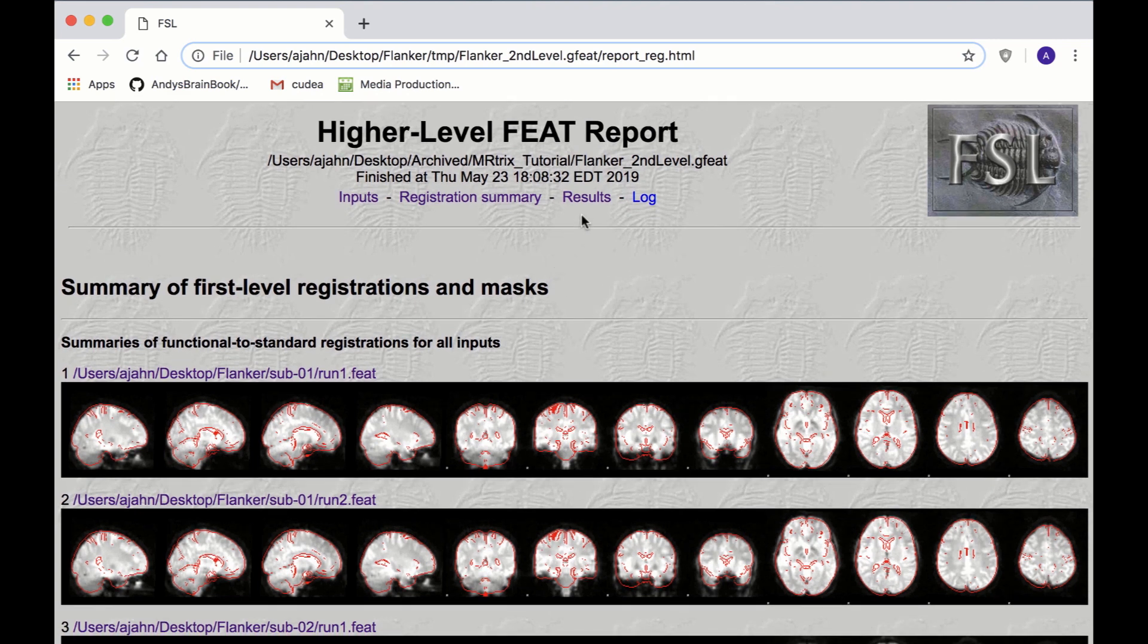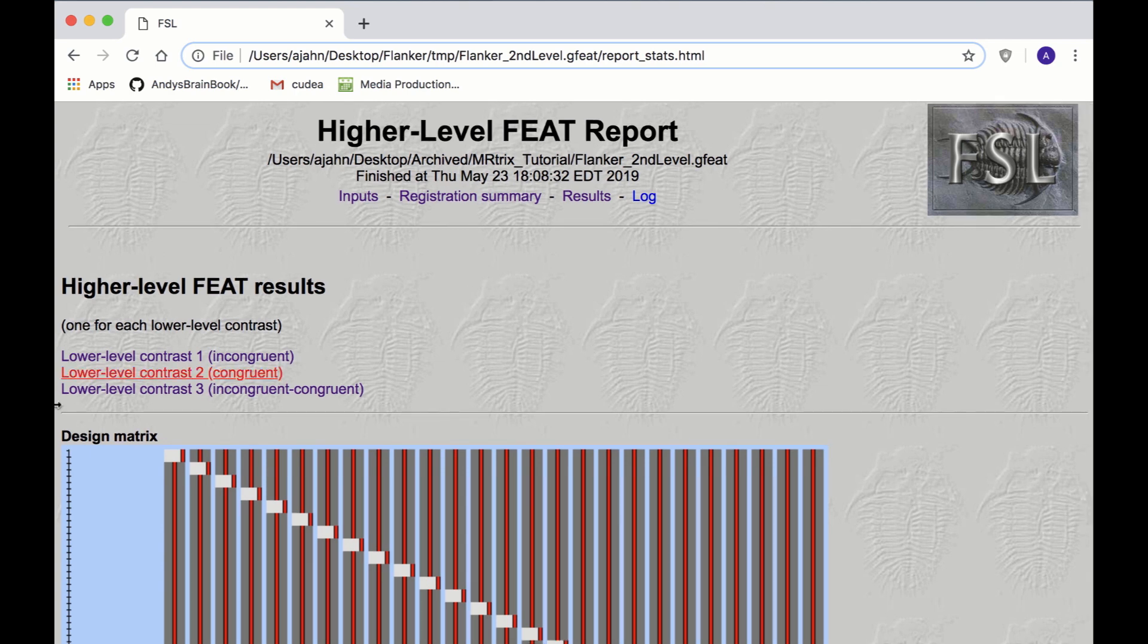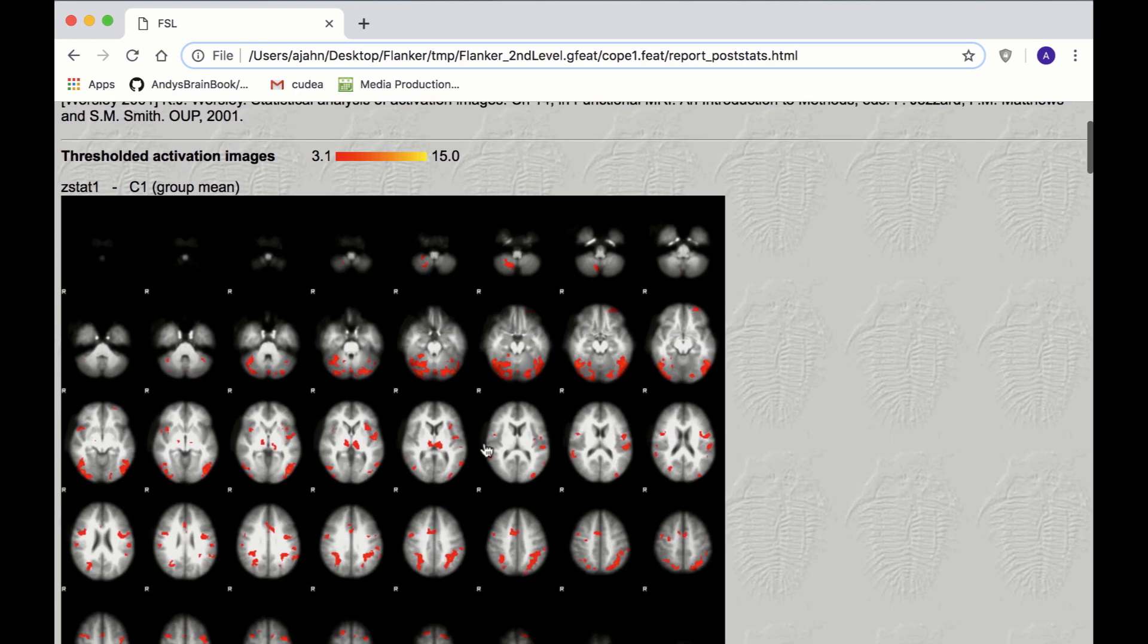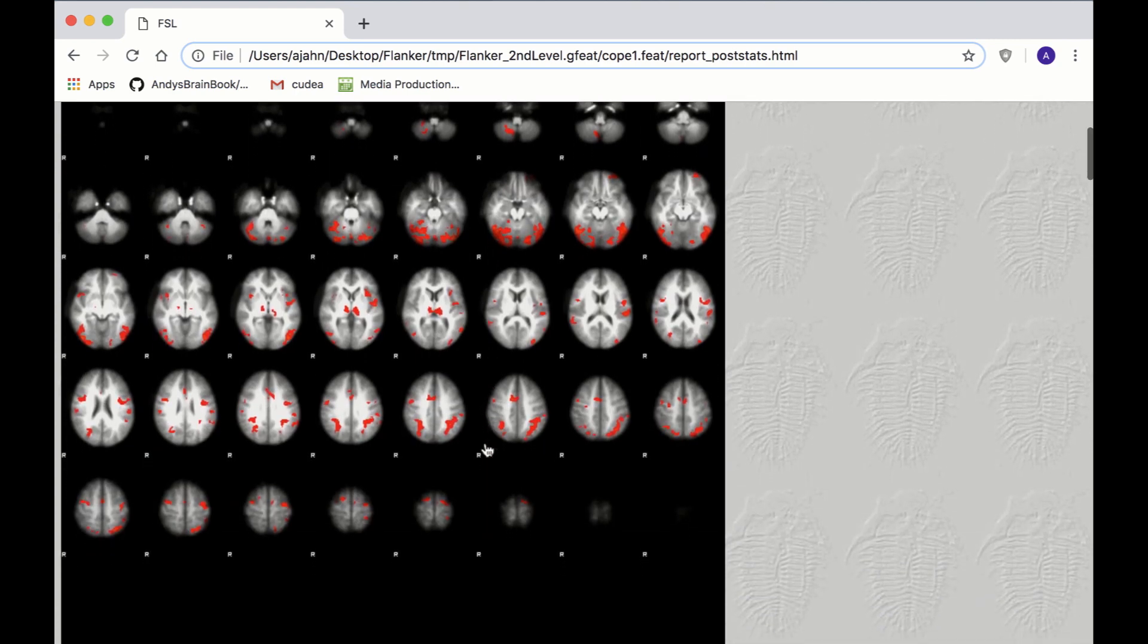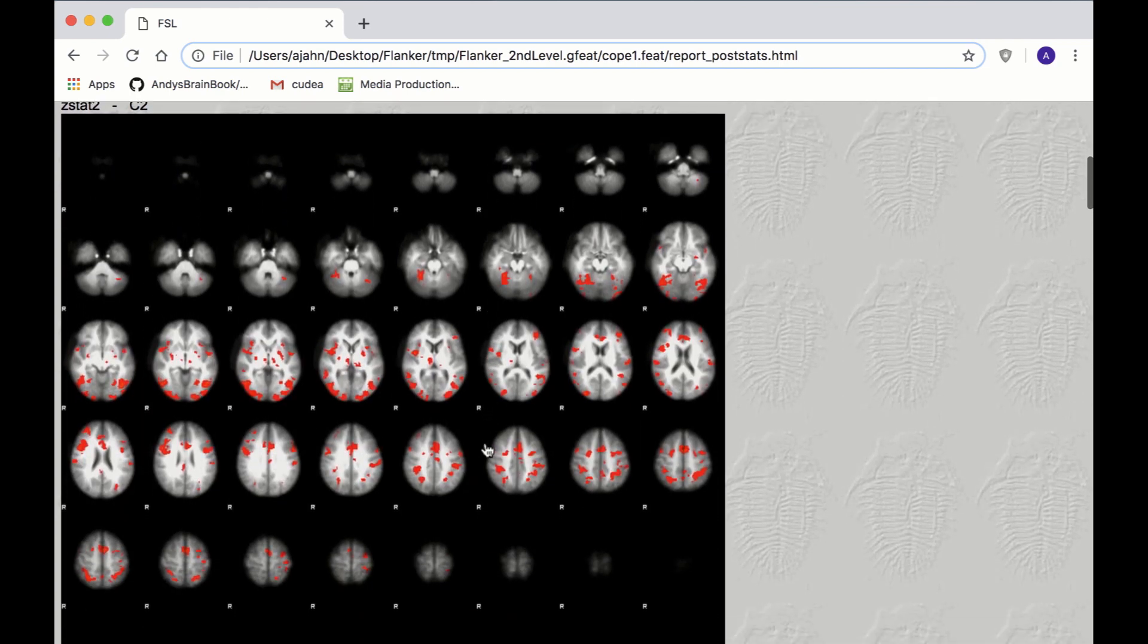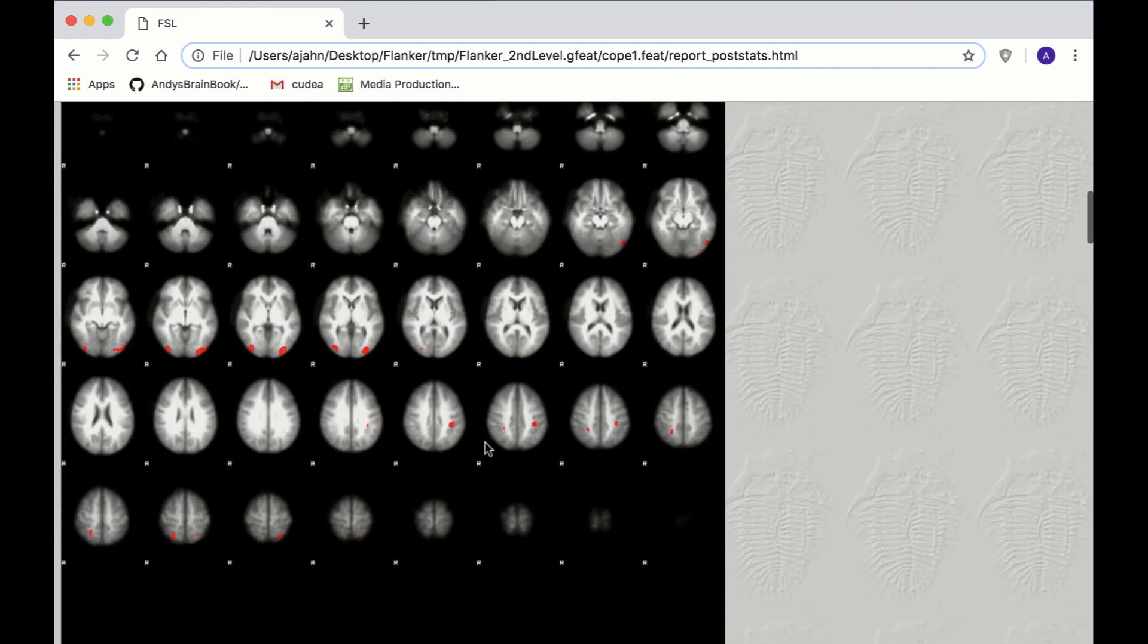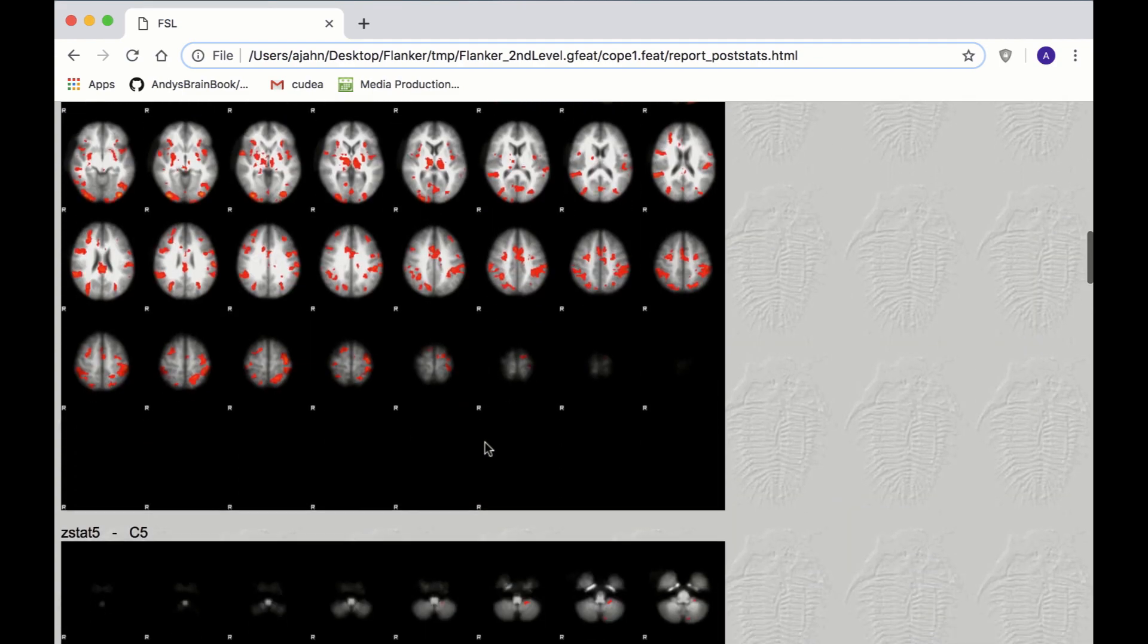The Results tab will show you the GLM for the second level analysis, along with results for each of the contrasts. As with the first level results, we aren't that interested in the Post Stats, but do check them for any activation in the ventricles or strong activation at the edges of the brain, which may suggest movement artifacts or other issues.